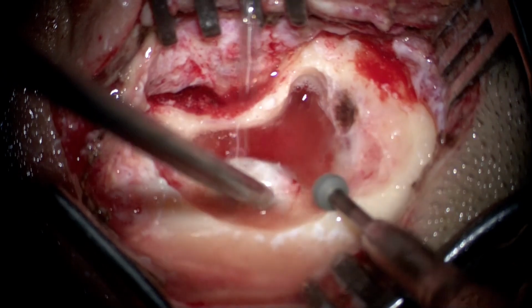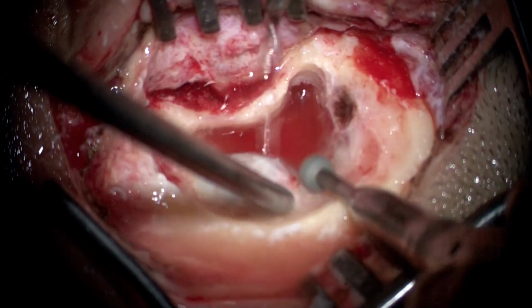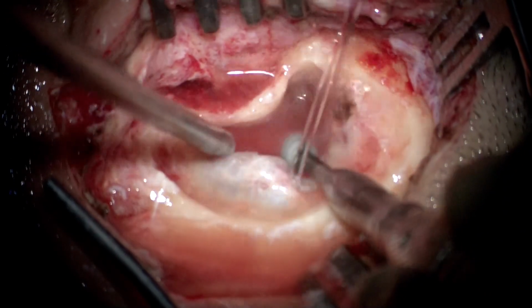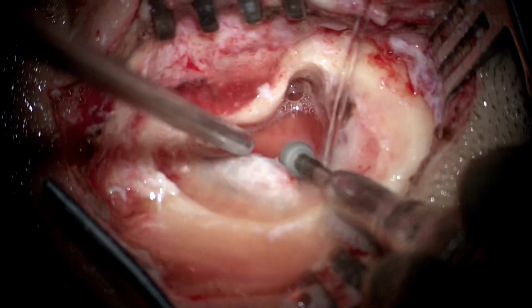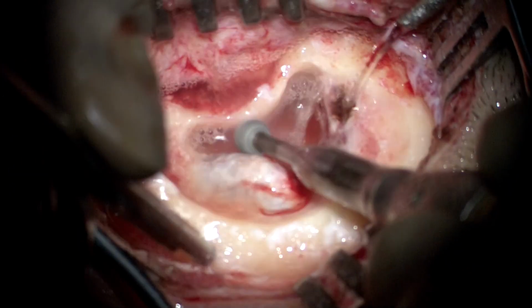Now, a large diamond burr is very, very safe to be used on the dural plate and the sigmoid sinus plate with a lot of ease. One has to just adjust the amount of pressure one puts. Some slight bleeding over the sigmoid sinus dura is very common and can be managed generally using ample amount of irrigation and sometimes bipolar diathermy.